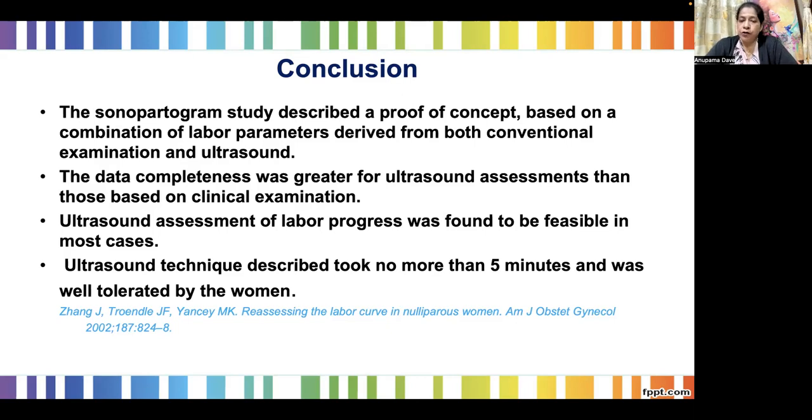Ultrasound assessment of labor progress was found to be feasible in almost all cases. This technique took no more than 5 minutes and was well tolerated by women.